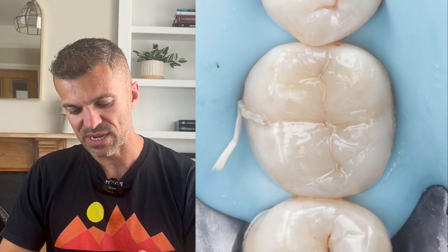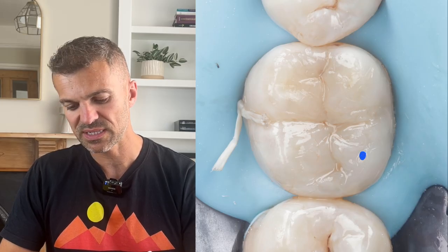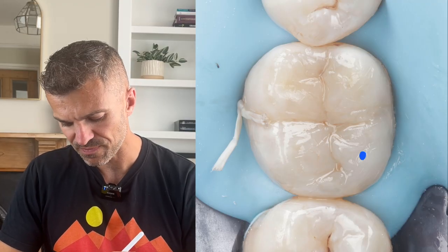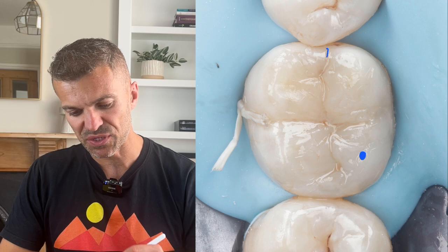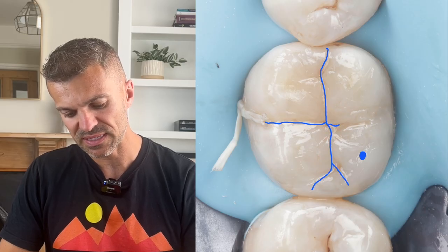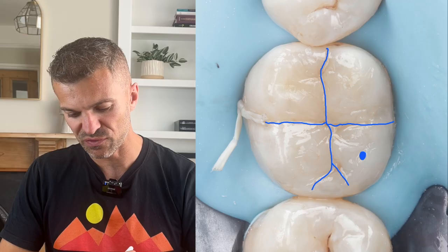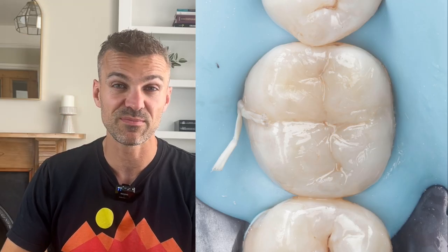The next step is to add in the occlusal anatomy. You can see that the cusp tip is about here — just inside of where the wall was that I've built. I'm using the anatomy of the tooth to just copy and carry on from the embrasures into my fissure pattern, and then here distally it's a combination of being guided by what the tooth is giving you as well as having a general understanding of the cusp anatomy that's needed. I hope that was useful and answered some of the questions on rebuilding a cusp tip in direct composite. Try out some of those methods and remember: keep it as simple as possible and don't try to overdo it with each increment that you're adding in.